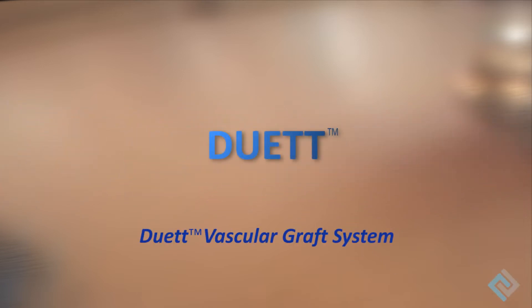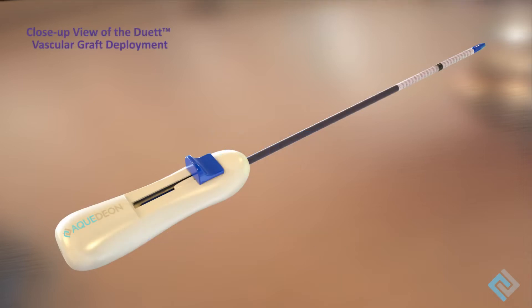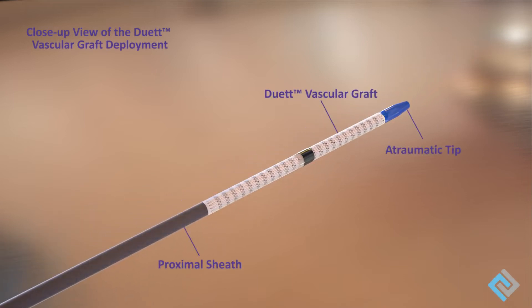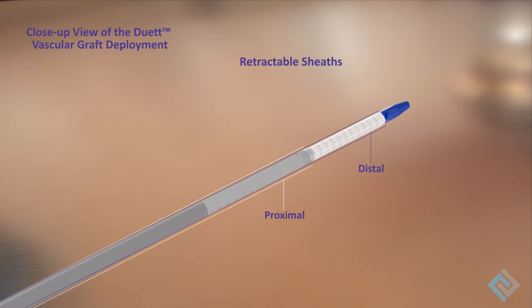The Duet Vascular Graft System enables rapid anastomoses that connect the patient's vessels to synthetic grafts. The system consists of a specialized delivery system and a self-expanding Duet Vascular Graft, which is compressed along with a uniquely designed suture cuff onto the delivery system by retractable sheaths.